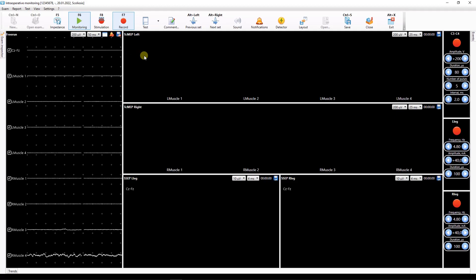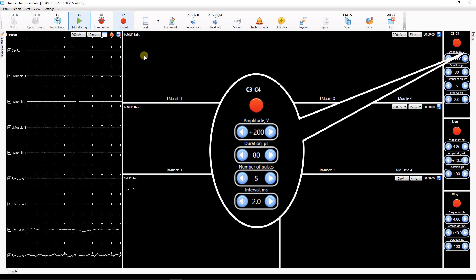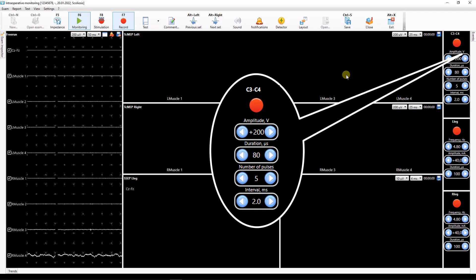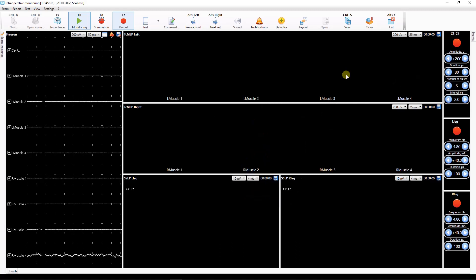Stimulators are controlled using the stimulator window buttons. Here you can turn stimulation on or off as well as adjust basic stimulation parameters such as stimulation intensity, stimulus duration and others.